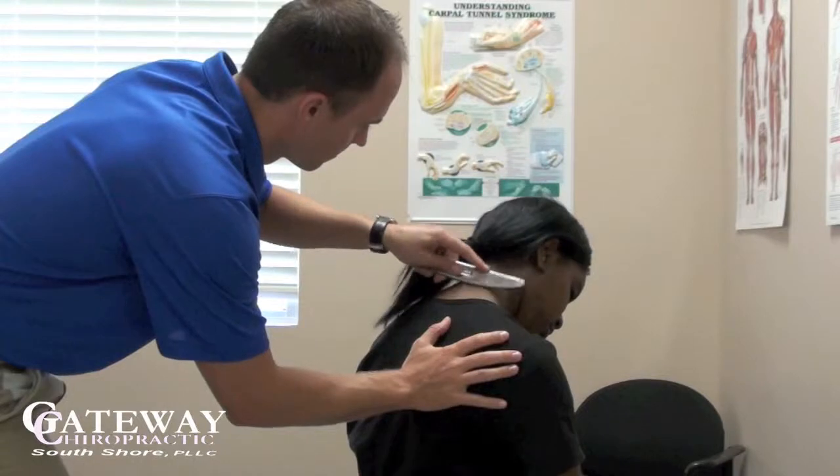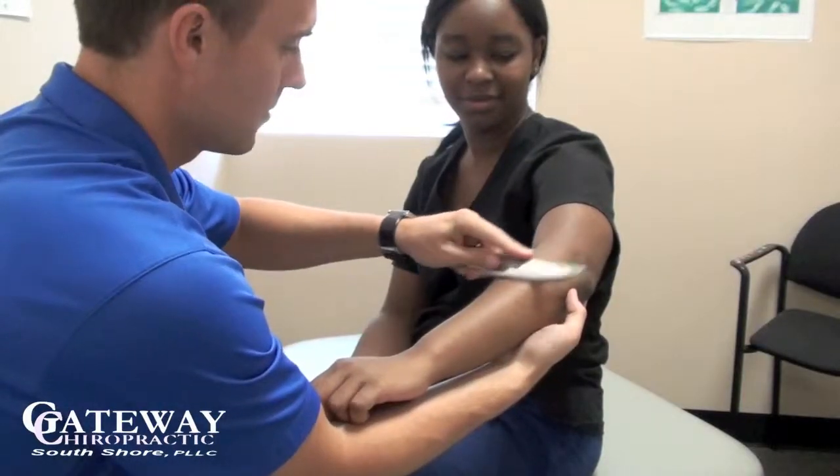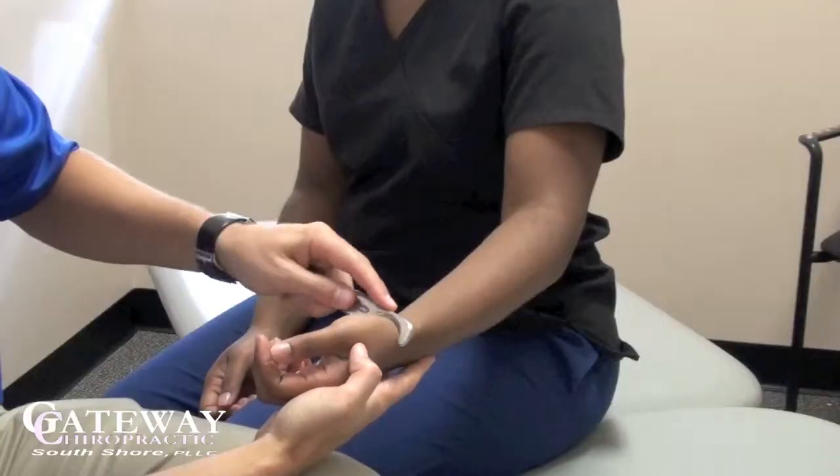The Graston Technique instruments, much like a tuning fork, resonate in the clinician's hands, allowing the clinician to isolate adhesions and restrictions and treat them very precisely.